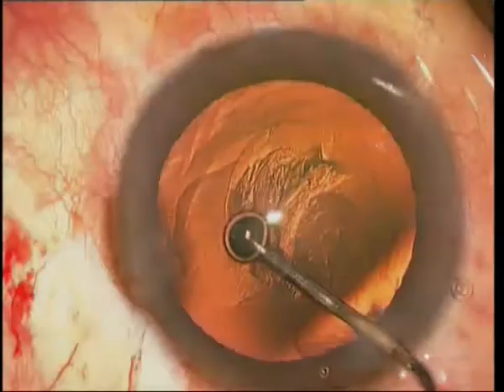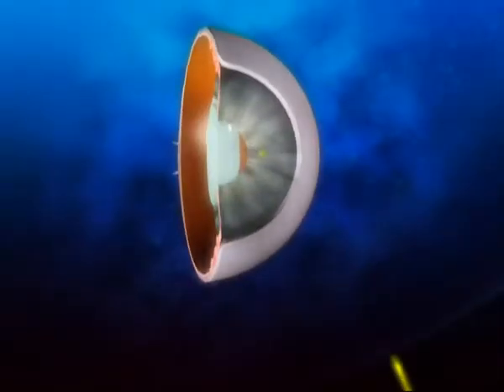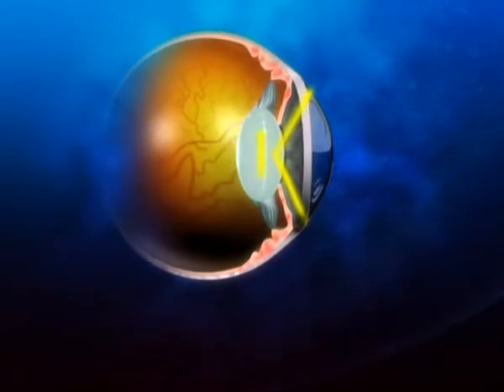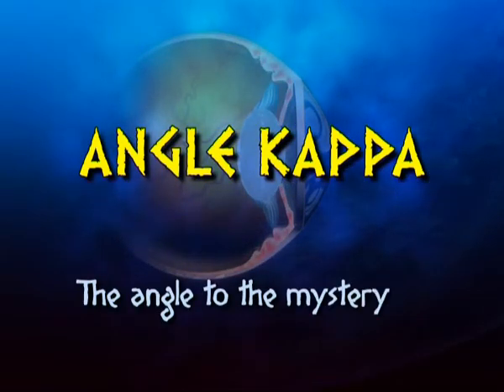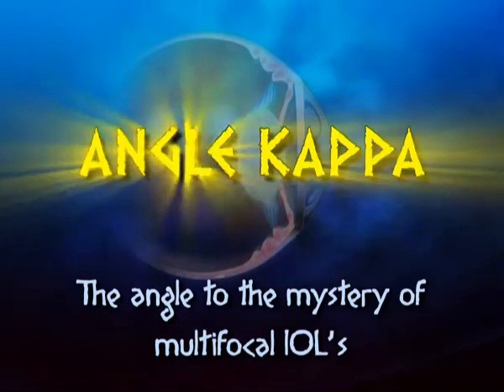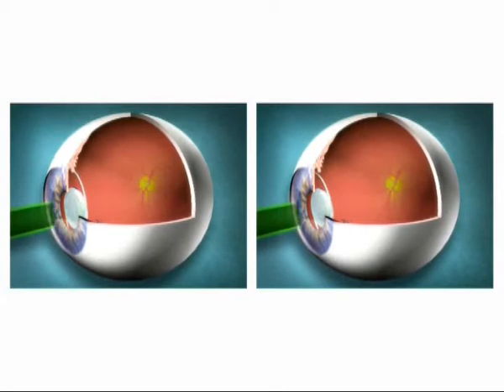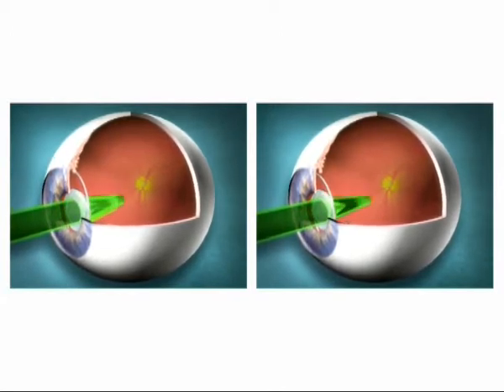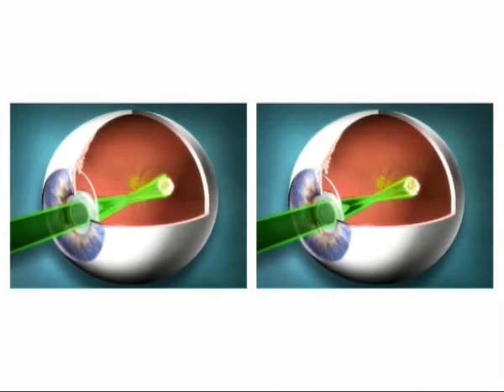But what role does angle kappa play for the cataract surgeon? We know that multifocal IOLs work by creating multiple focal points which focus for distance and near.